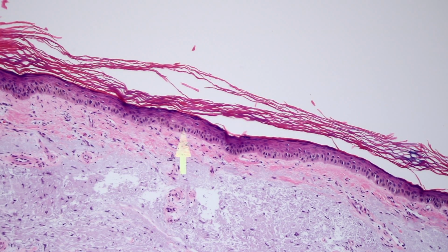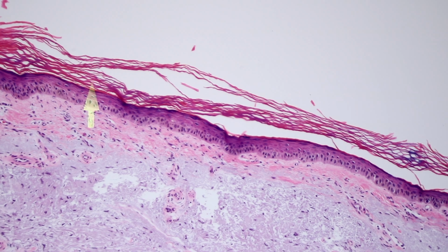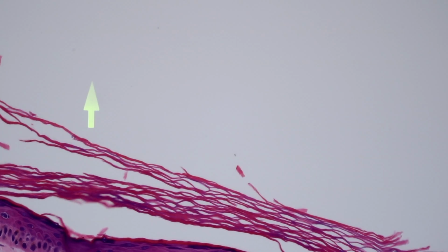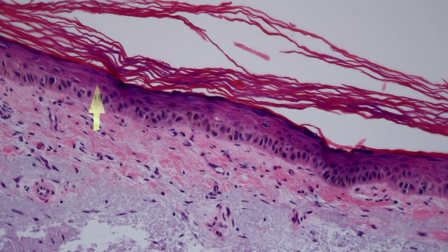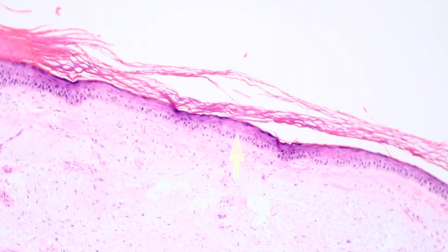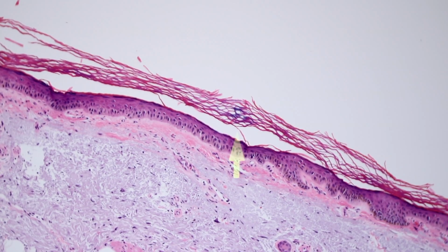So to me, this is part of the actinic keratosis, but it's kind of surprising that there's no parakeratosis over top. So again, we teach that usually you have loss of the granular layer and parakeratosis in actinic keratoses, but sometimes we see ones, particularly it seems the pigmented ones, that tend to not follow that rule. And so you could also make the argument that maybe this whole thing is just a solar lentigo, where you have a little bit of basal layer atypia just because it's been cooking in the sun. Whichever way you want to go with that argument, it doesn't really matter. The point is it's not melanoma.